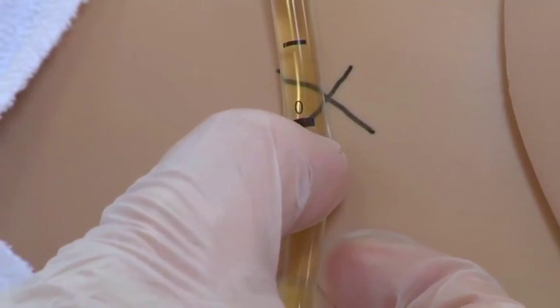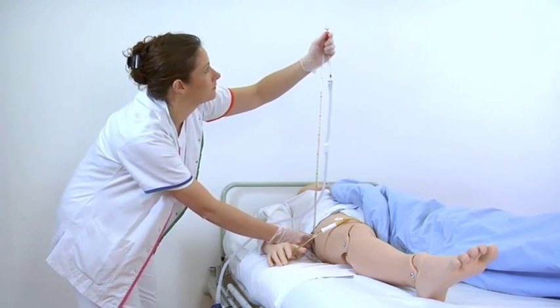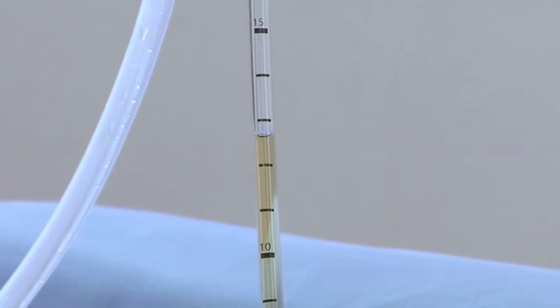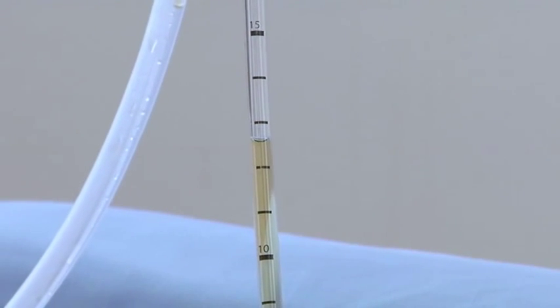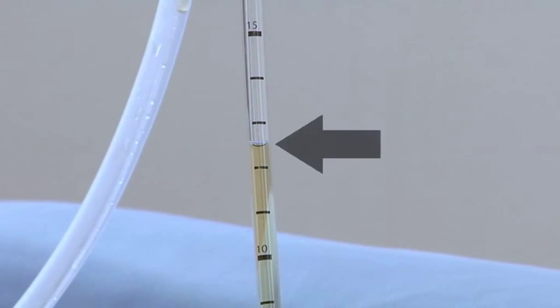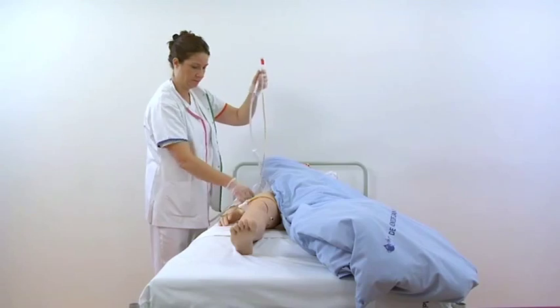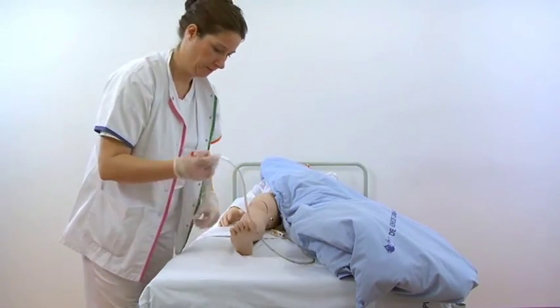Repeat the measurement at the time interval prescribed by the doctor. Open the red clamp at the end expiratory state and read the urine level. Close the red clamp on the unometer abdo pressure and place the tube around the leg of the patient.